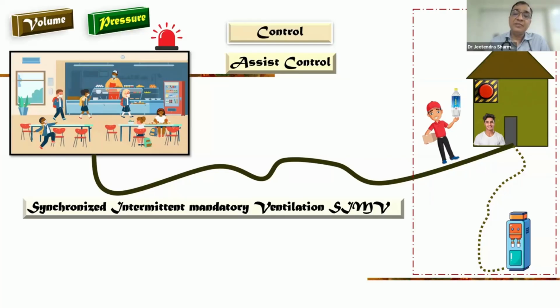Till now, you understand what we are talking about. There is no interaction between the delivery boy and you. Whatever complaint or change you have, you have to go to the manager. Similarly, you have to change the setting over there. So if you think your 300 ml is less, then you come to the manager and say, next time, all the time it will be 500 ml. You can't change it in between.